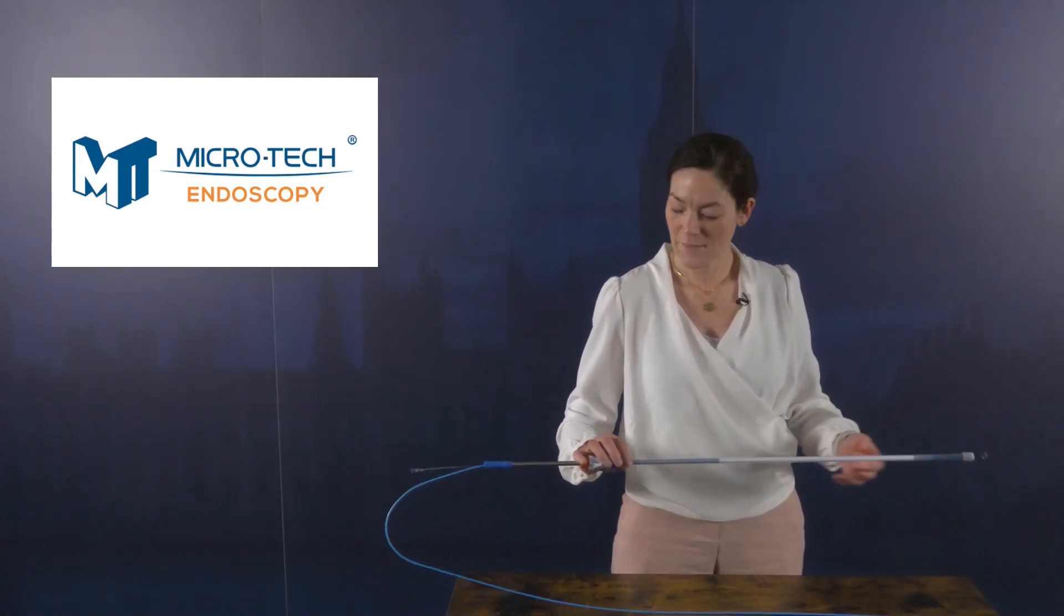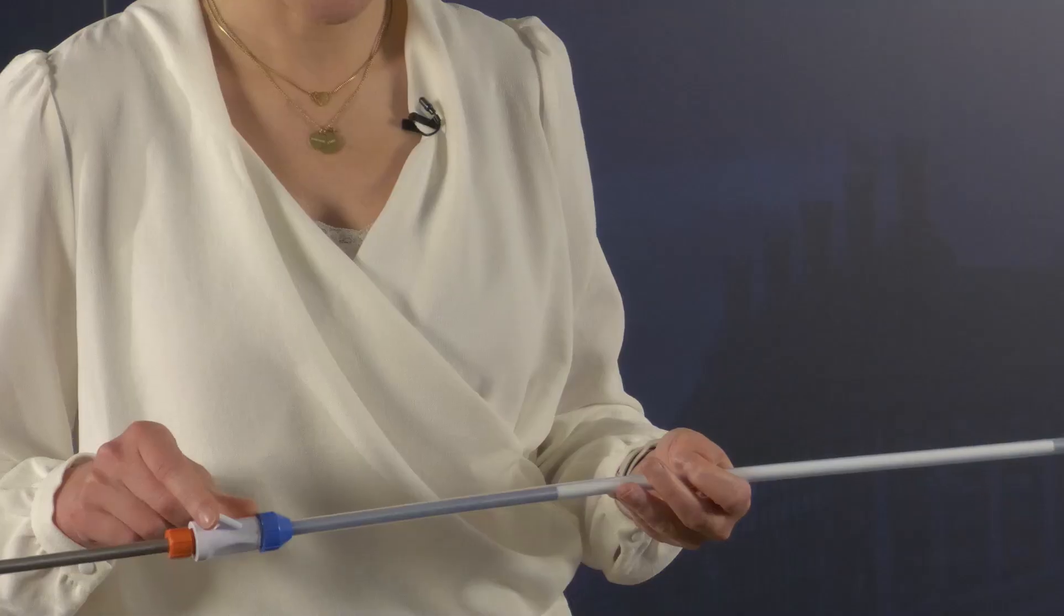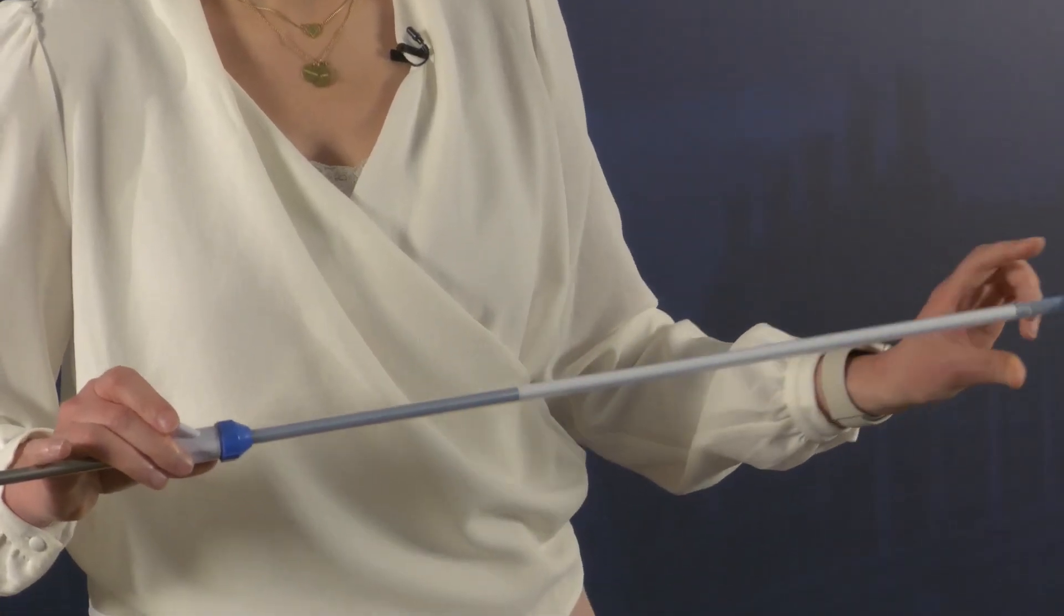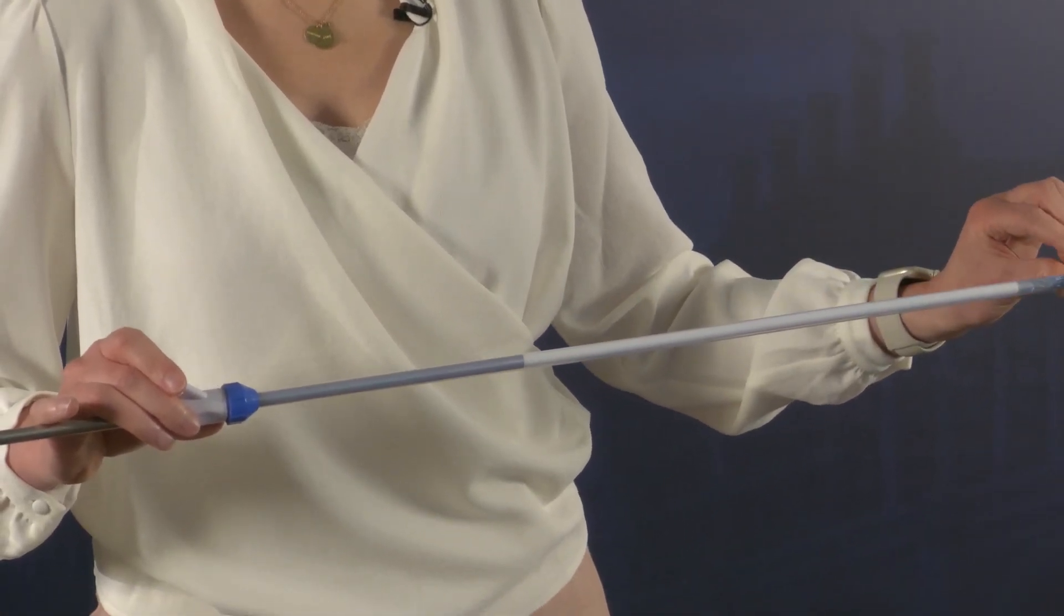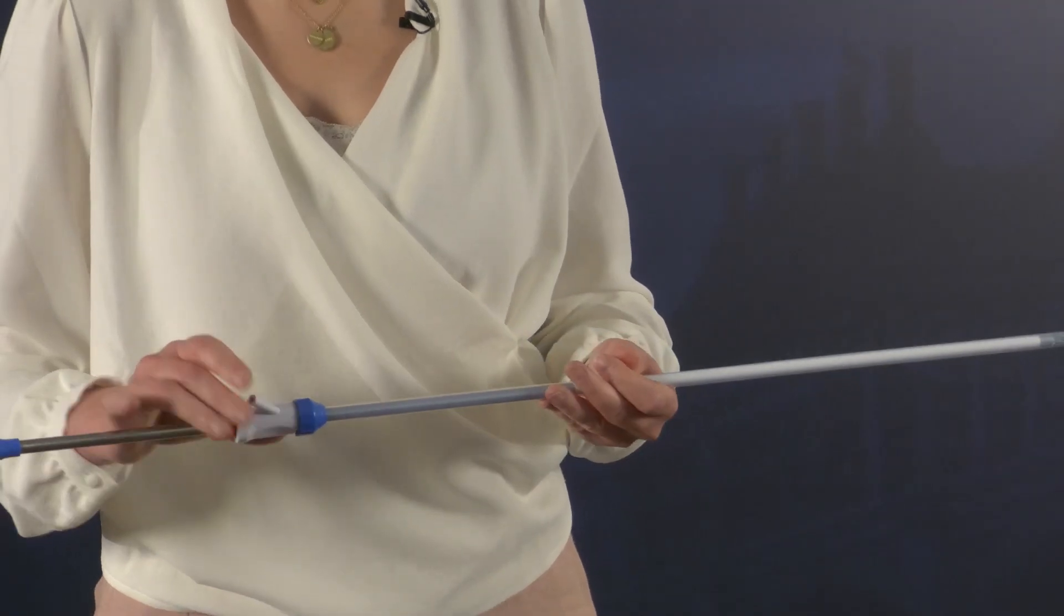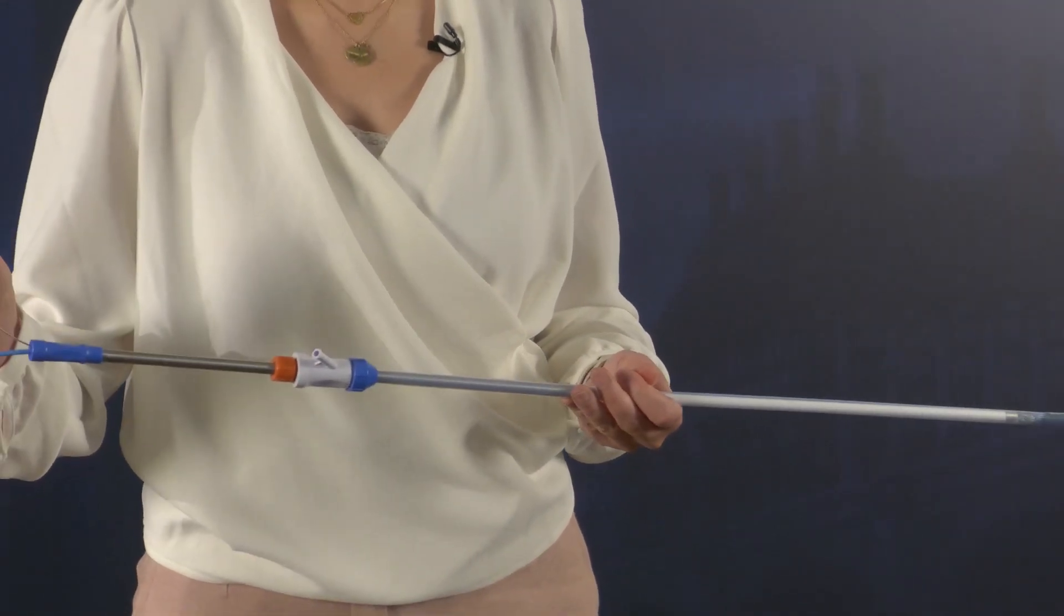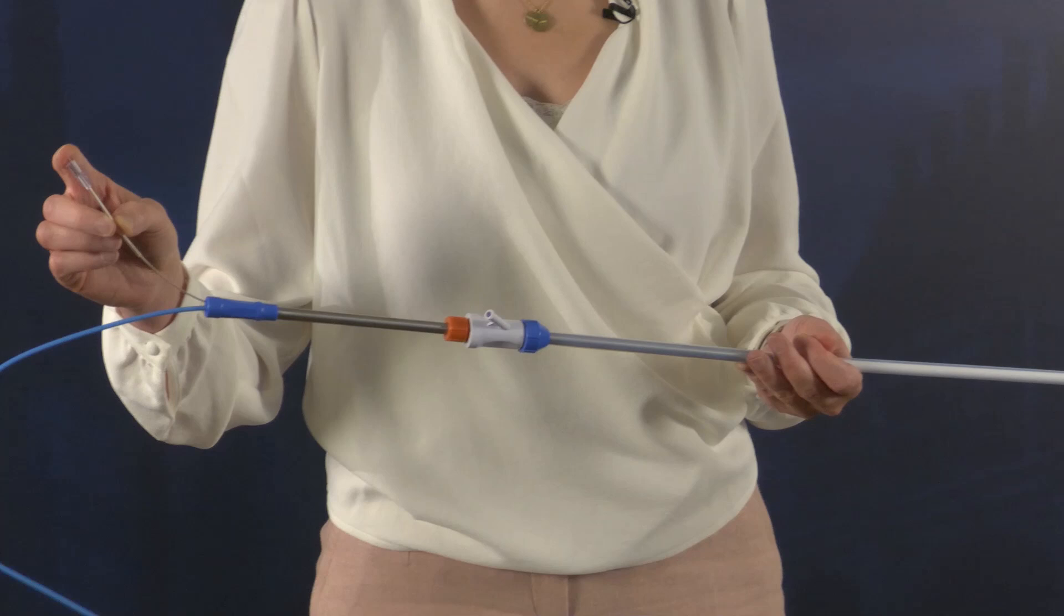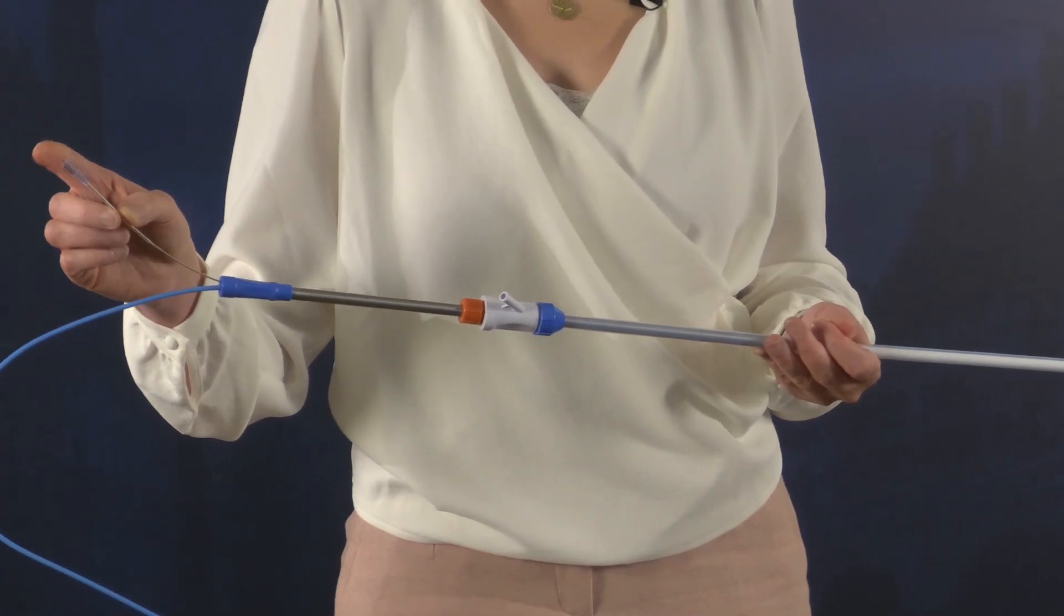What is important then is also to flush this channel, which facilitates deployment of the stent later on, and you have to flush this channel, which is the channel that is used to put the guide wire through.